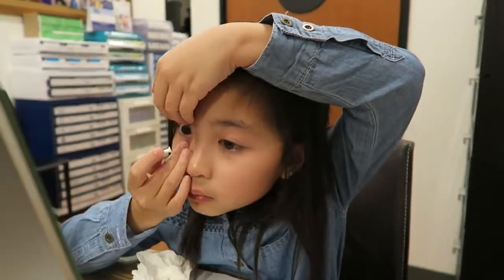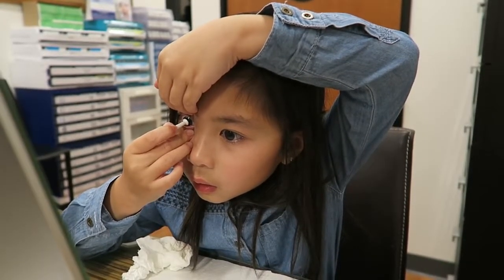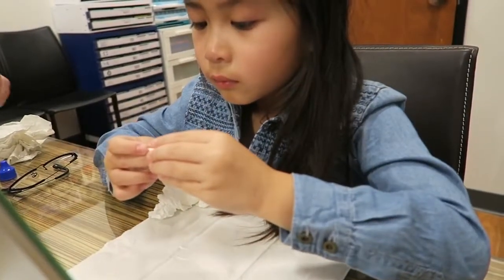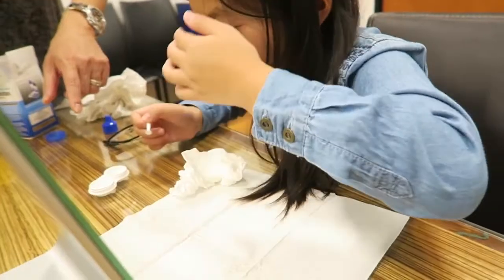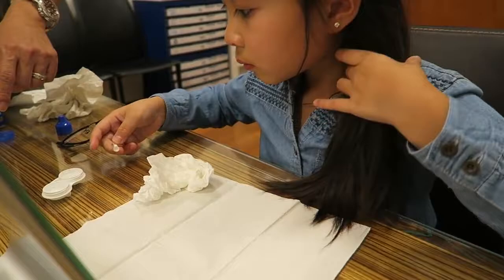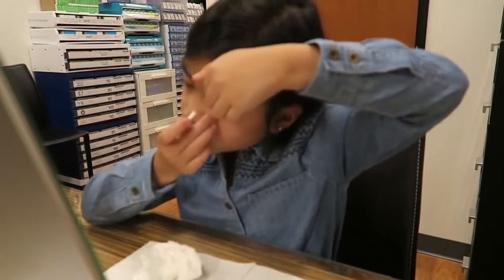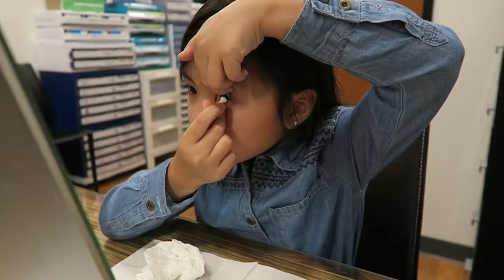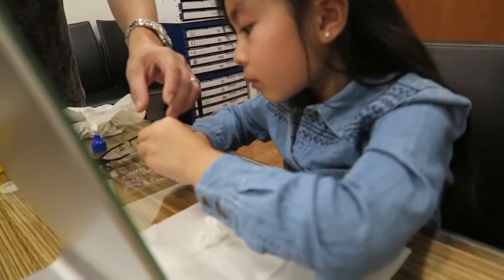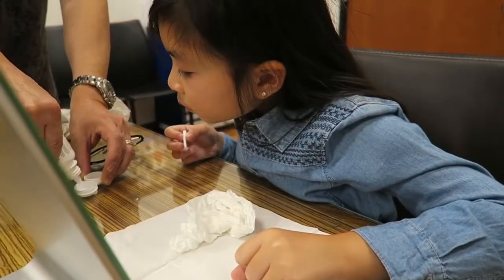Make sure you sit closer to the table — we don't want to drop it on the floor. Good job, take them out. You've got to break the suction — twist them out. Put it there and let it sink down, poke it down. Good job! Twist it. Put them in there. Good job, I love it you guys.